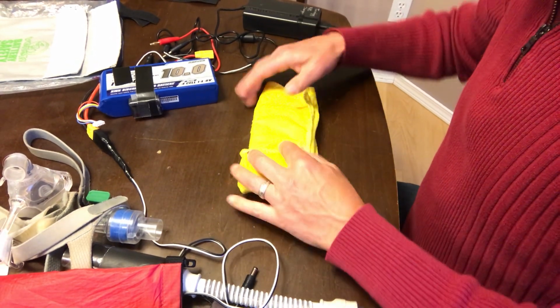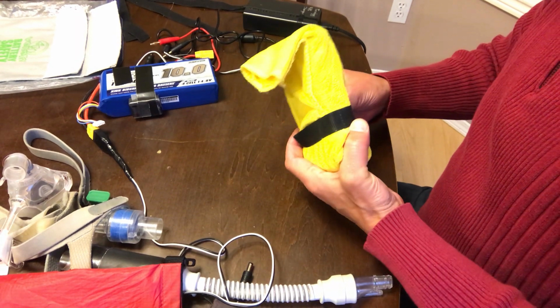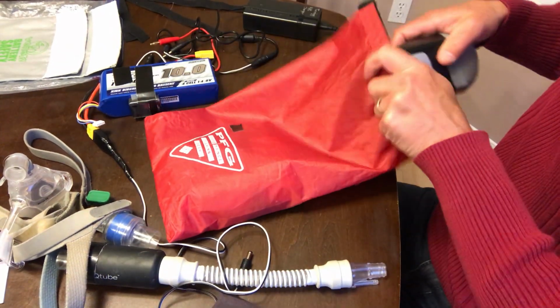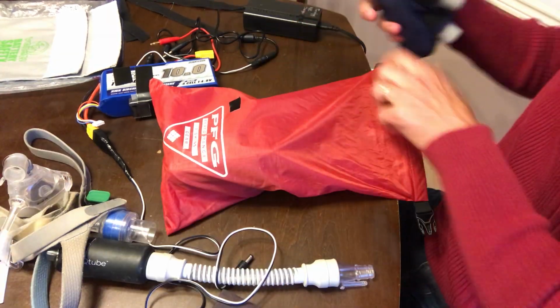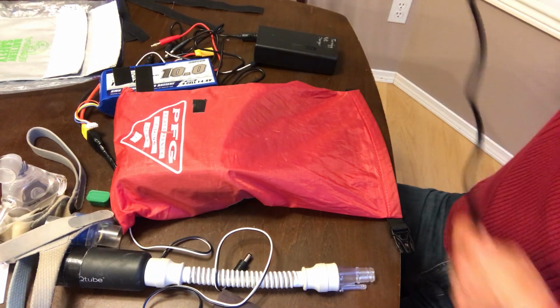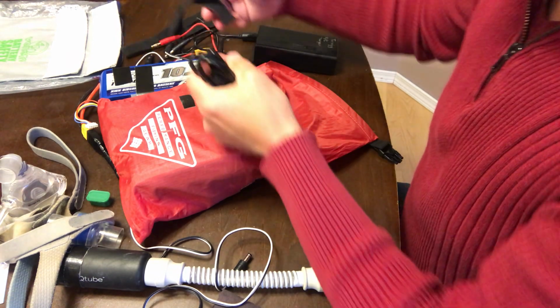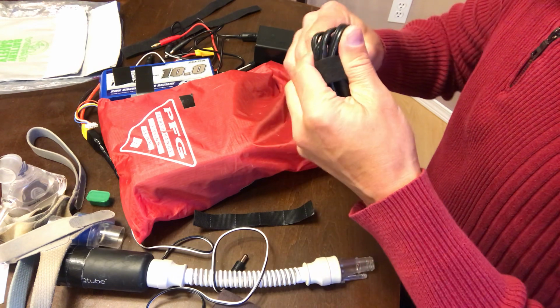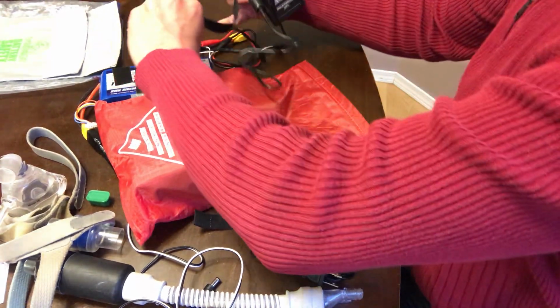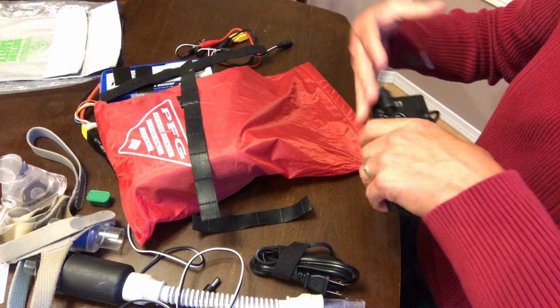So I fold this over, and I use one of these strips, like so. So I put that down in there, and then I put this one right on top. Then I put the hoses in next to that, right at the end. And then this guy would fold up. And then I have 2 little strips here. One for this one. And then I would use another long one. These were all the long ones are the same length, and the short ones are the same length. And this here, like so.